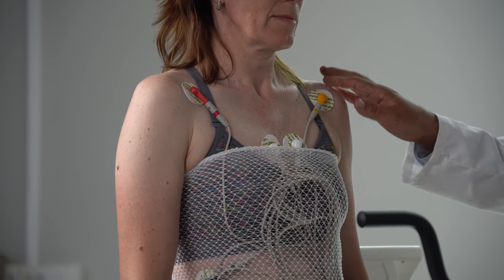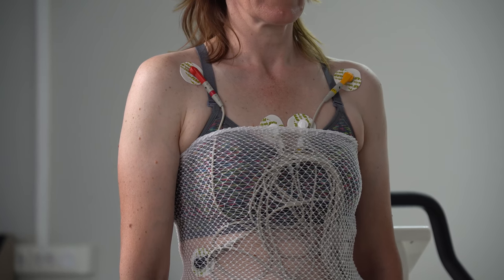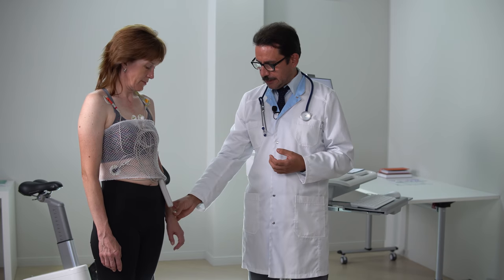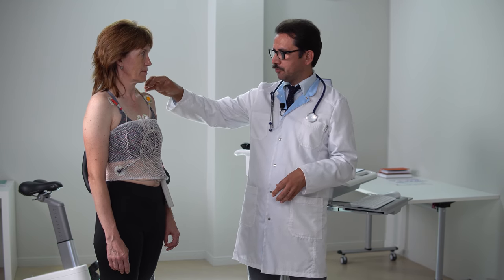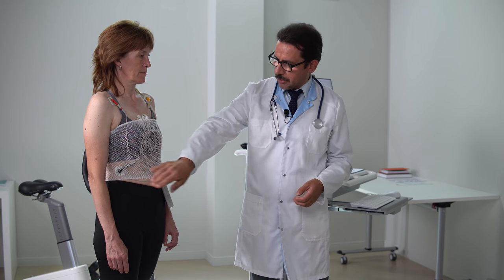So here we have the electrodes placed, and this electrode placement system is known as the Mason-Likar system. It is a special scheme that is quite different from the standard lead position, and it is proposed for exercise stress testing. Why? Because in the standard lead position we use the wrists and ankles to place four electrodes. But in our case, our patient's arms and legs will be moving during the test. So it may cause a lot of noise on our ECG. That's why we move these electrodes from the limbs to the nearest part of the trunk that may imitate the normal lead position. So on the shoulders and here on the trunk.